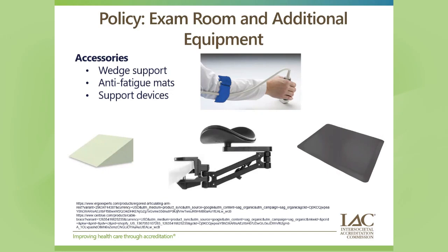All right, so then there's additional equipment that we can invest in that will help us and our patients with ensuring that we're having the best level of comfort for the exam. Wedge support is highly helpful, especially if you're working in a place where maybe you don't have all the bells and whistles on your bed. So instead you've got that wedge support for a patient's back. Some patients need a little bit more support than others, and so having that additional wedge support is helpful, whether it's for their back or under their knees or between their knees.